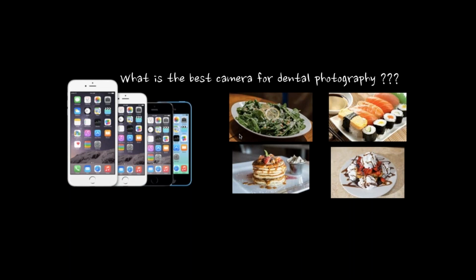Can I use a digital iPhone or a digital cell phone to take a facial picture for reference of plane? Yes. And if you're setting denture teeth and you don't need color matches and you don't need real detail, probably better than not having a great camera system. Can I use it for video today? Yes, the video cameras on these phones are fabulous. And I have a whole lighting 4K camera setup that I have not used in 4 years. Why? Because now I can grab my iPhone and film that video and get just as good of quality.